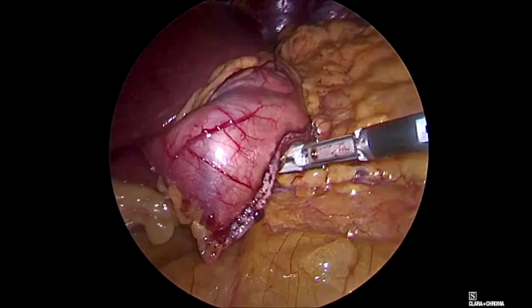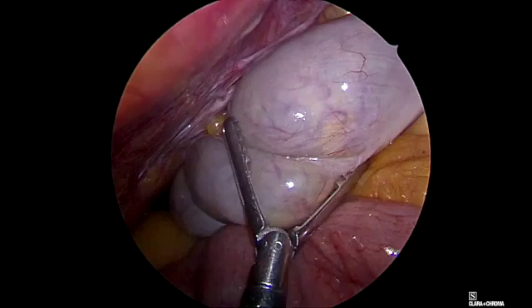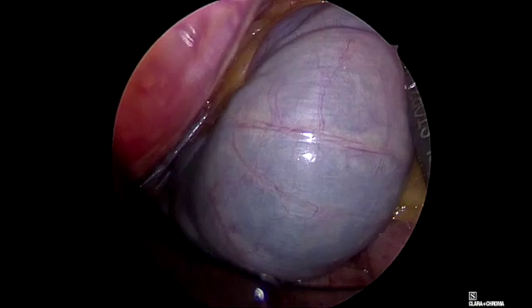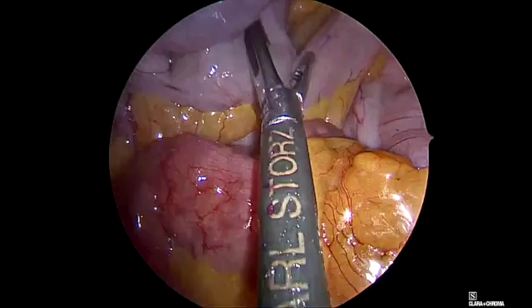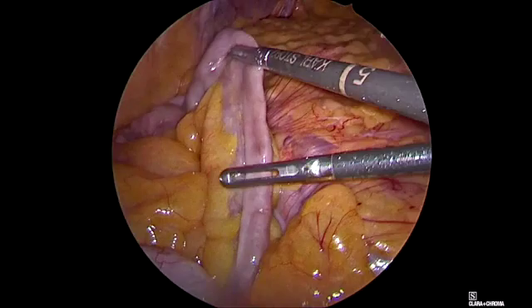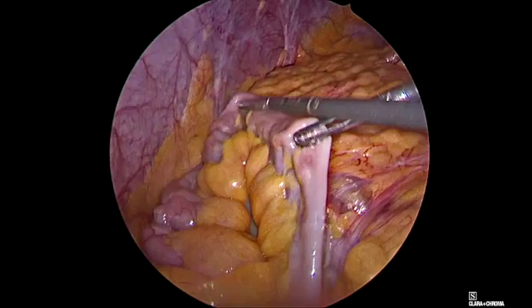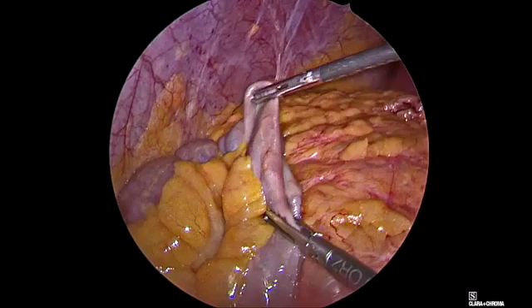Now it's important to lift the stomach a bit with the bougie tube inside, as we're going to deal with it in a moment. We're looking for the ileum — normally the first assistant on the left side of the surgeon finds it. The ileum is just found, and now we go measuring five centimeters by five centimeters. In this case we are going to do the anastomosis 280 centimeters away from the ileocecal valve.